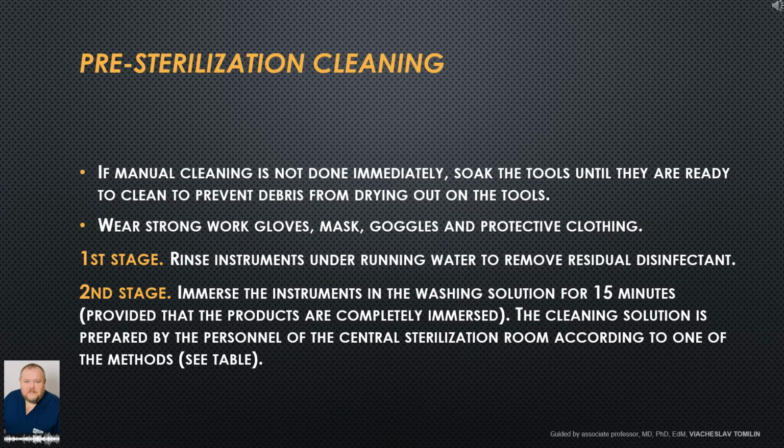Pre-sterilization cleaning. If manual cleaning is not done immediately, soak the tools until they are ready to clean to prevent debris from drying out on the tools. Wear strong work gloves, mask, goggles and protective clothing. First stage: rinse instruments under running water to remove residual disinfectant. Second stage: immerse the instruments in the washing solution for 15 minutes, provided that the products are completely immersed.